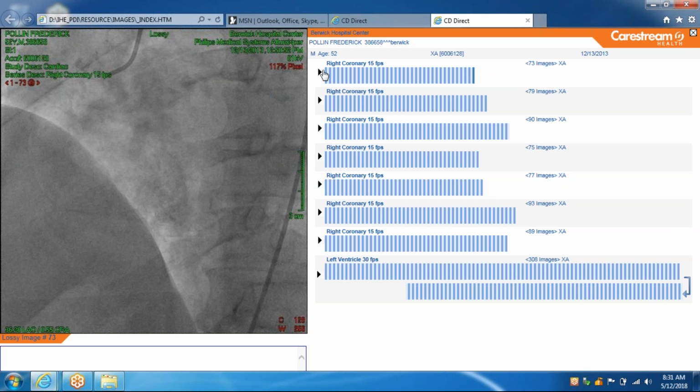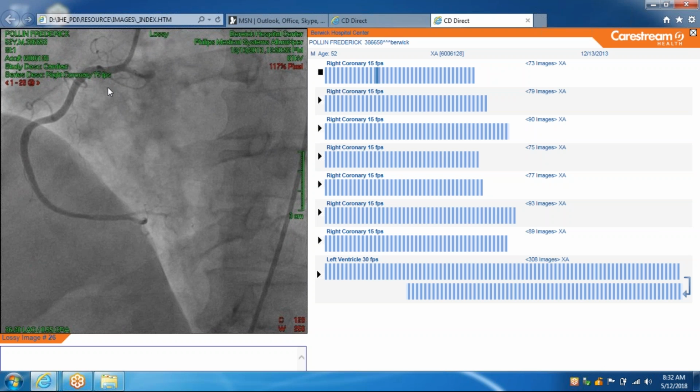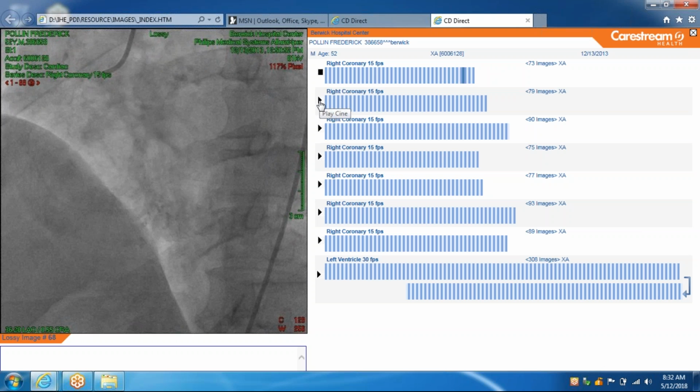So again, when you cannulate the right coronary artery, I usually look at least two views. If it's looking normal, a minimum of two views I would image. If it's abnormal, then I'll probably do more. So again, you inject the dye in the blood vessel, you take the pictures, and you can just see what the blood vessel looks like.